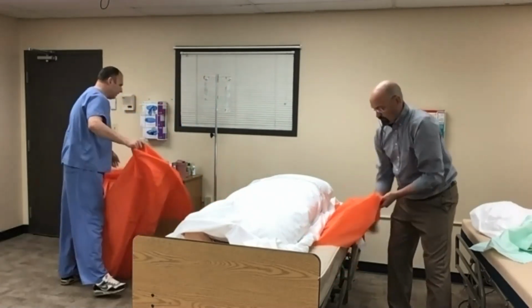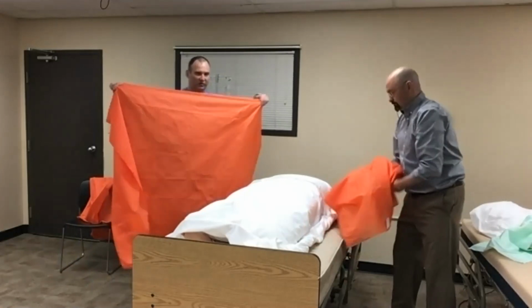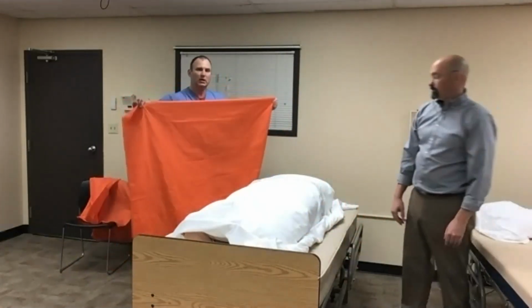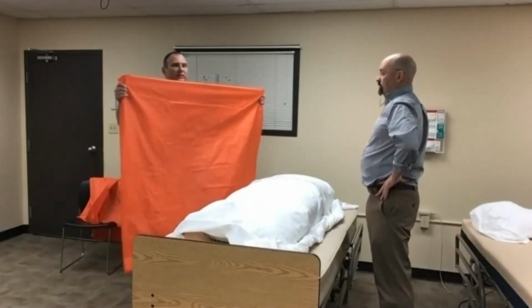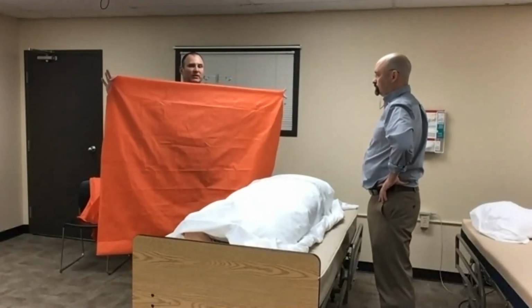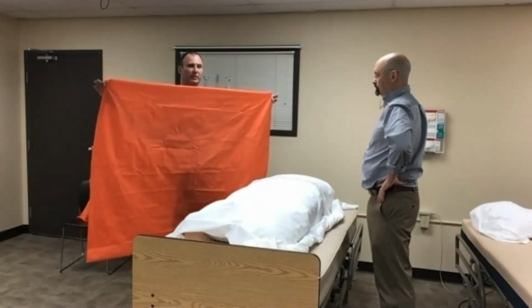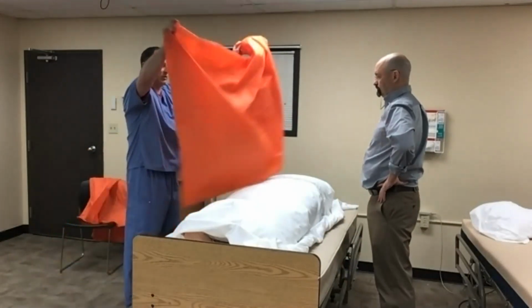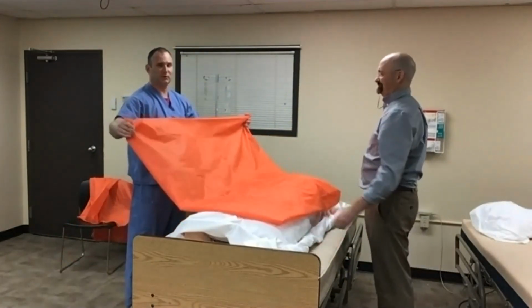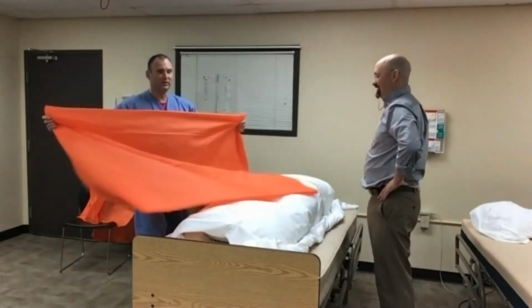if you have a big enough one, okay, this is a bariatric one, so it's going to be on each side, okay? But what I'm going to do is we're going to get this underneath the patient without rolling them. I'm going to hold this. Obviously, I'm 6'3", so it's a little easier for me, but if you needed to, you could use the patient as a table, which we're not supposed to do, but if you had to, okay?